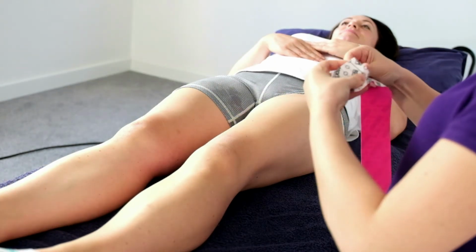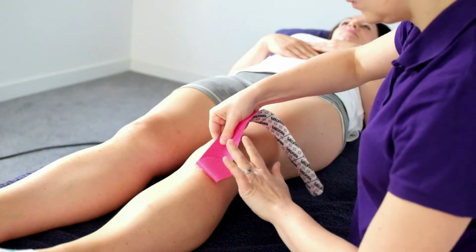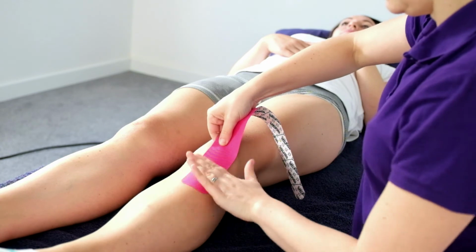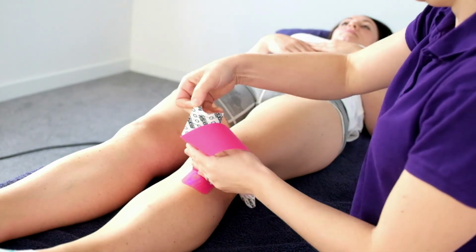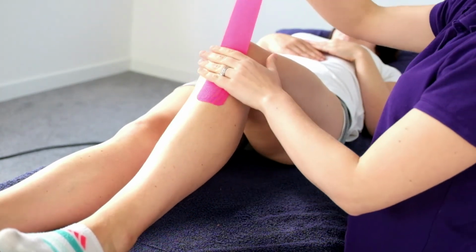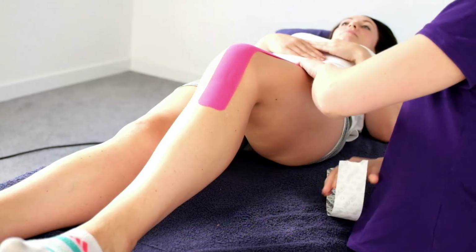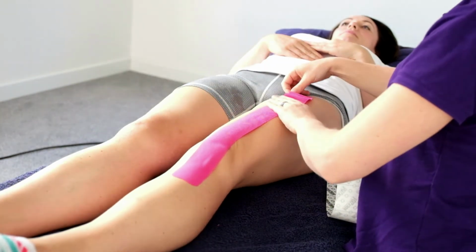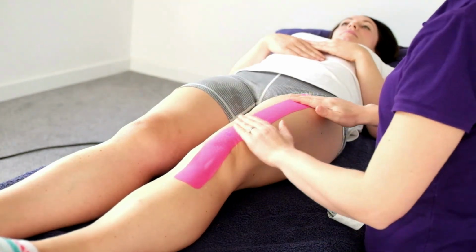So we begin with inhibition taping for the quadriceps. We make a long anchor of the tape, applying it on the tibial tuberosity and sticking it down on a relaxed knee. We then apply a stretch onto the tissue by bending the knee, and with light tension on the tape, we apply the tape along the midpoint to the centre of the quadriceps muscle group. We then straighten the knee to attach the anchor on relaxed tissue and then stick the tape down.